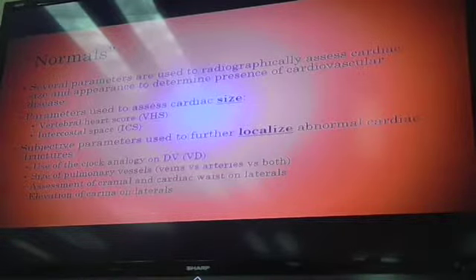Because you had to get through those in order to say, I want to do chest radiographs to even start, right? So once you got these chest radiographs, because the dog came in coughing, you have abnormal peripheral pulse rhythms, and you want to see what's going on with the cardiovascular system, okay?